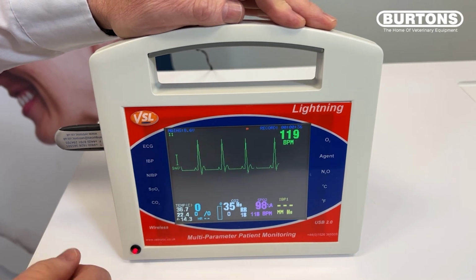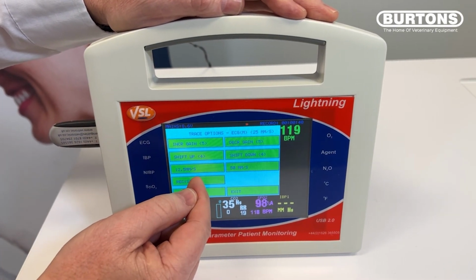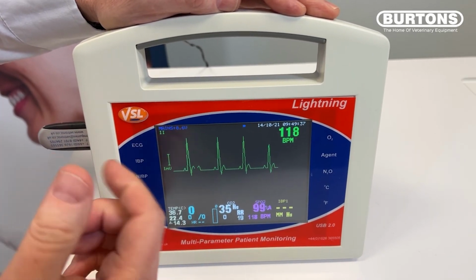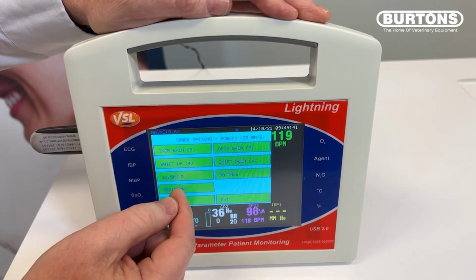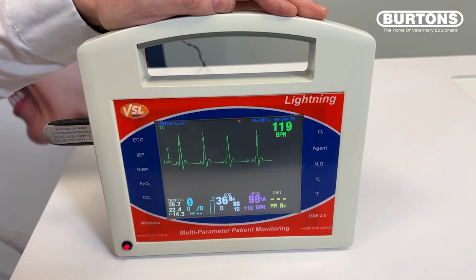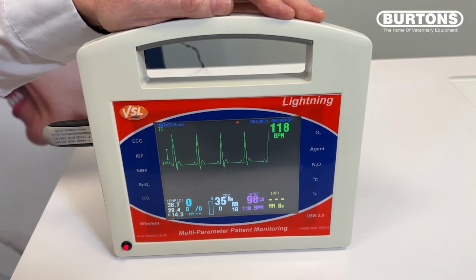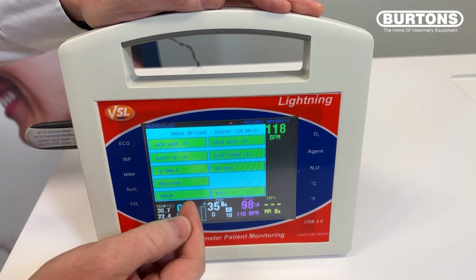It's a very simple procedure to stop the recording. Simply touch the trace again and hit record stop. And now we see that it goes back to the date and the recording is saved. Nothing to stop us going straight in again, doing another quick recording, and these recordings will appear as separate recordings, time and date stamped, when we come to look at them in the software, the vital monitor software. So a very simple procedure, but it is a very useful feature to have.